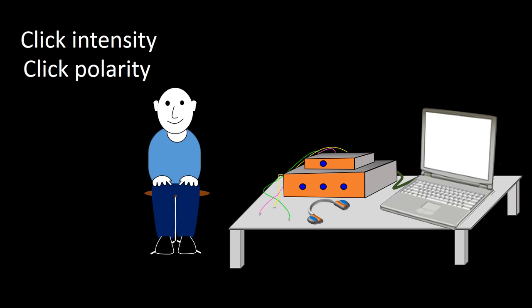Most of the current machines have internal calibrating systems. These machines require little understanding of the process required to properly calibrate an instrument. Hence, I will only talk about the general principles related to calibration that I think will give you a leg up on the clinical use of the equipment.